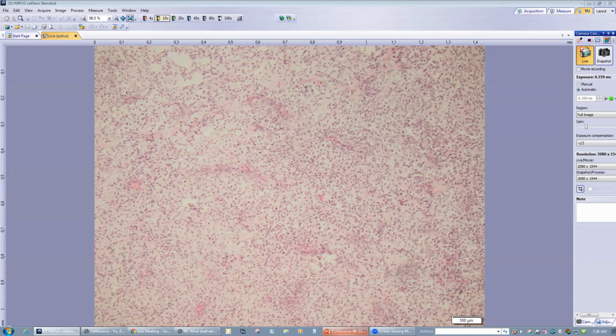The infantile fibrosarcoma is usually in the soft tissue, while this represents the kidney. Their morphology is kind of similar. So some tumors are really morphology driven by those genes. Interesting. As we know more about those genetic changes, probably all the tumors should be subclassified by the genetic change.